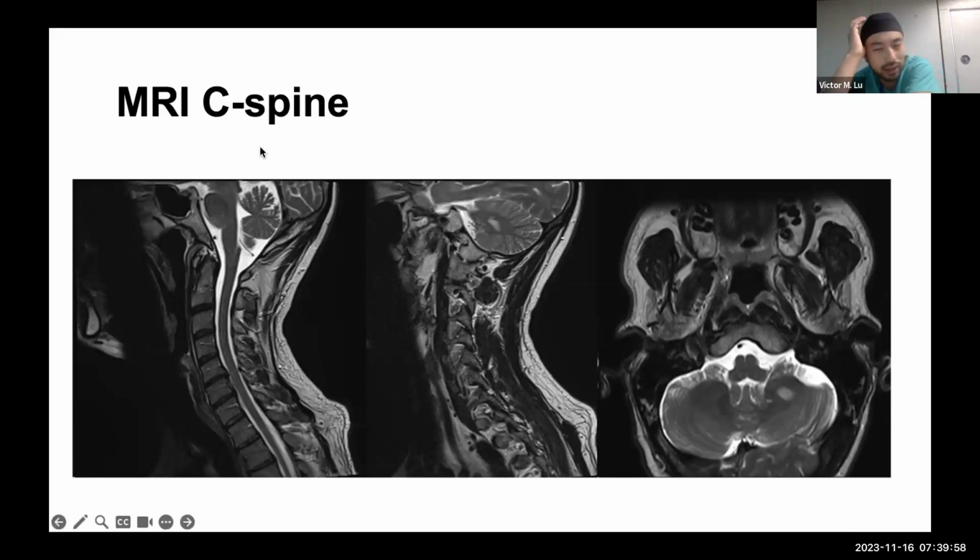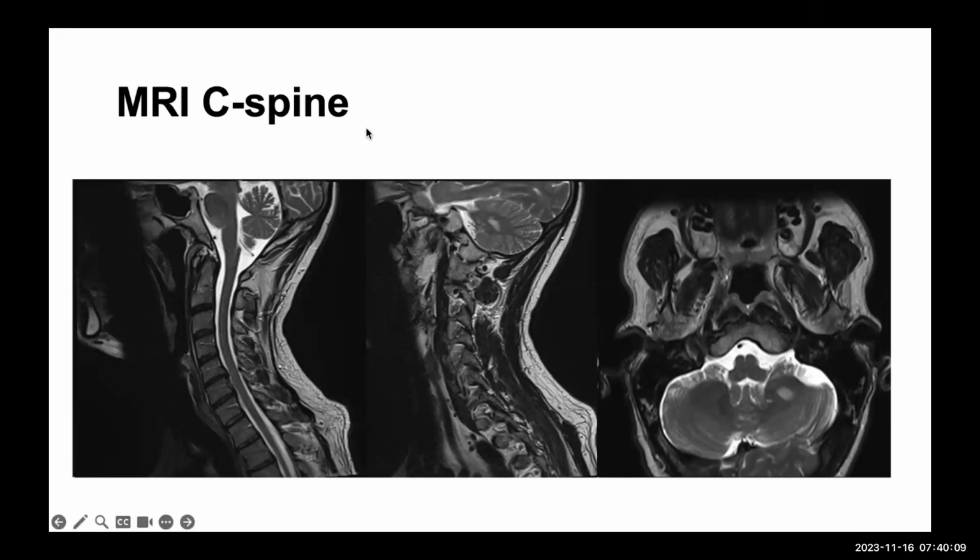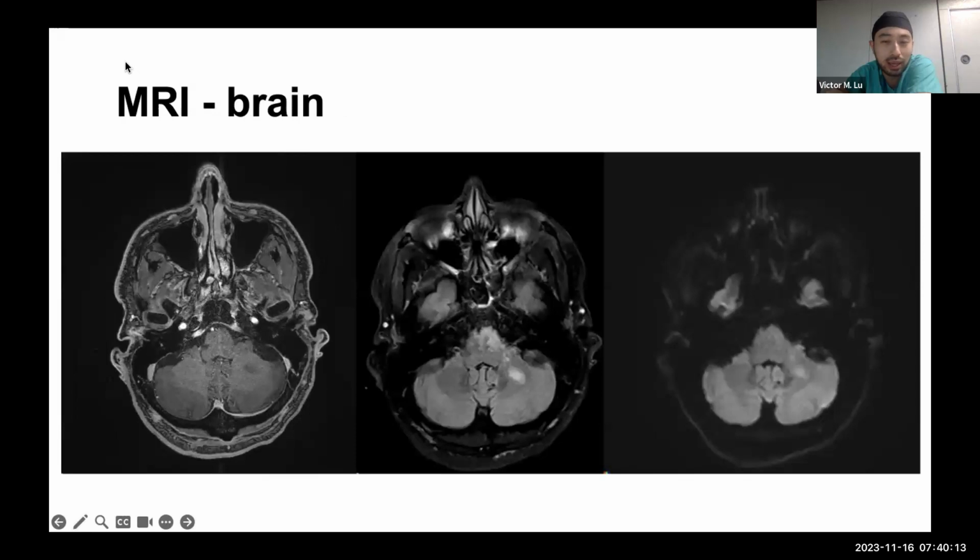Yeah, that's fine. So yes, exactly. All of a sudden you're looking at the C-spine, but you catch something in the posterior fossa. So you would want dedicated imaging, correct? Yeah, that'd be my next step. Okay, so you go ahead and get dedicated imaging of the posterior fossa at this point. So why don't you tell me what sequences these are, and what can you see?